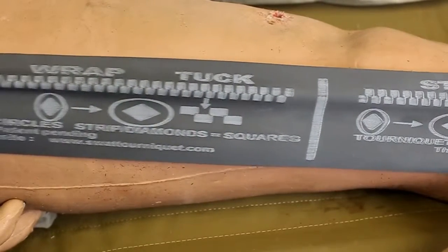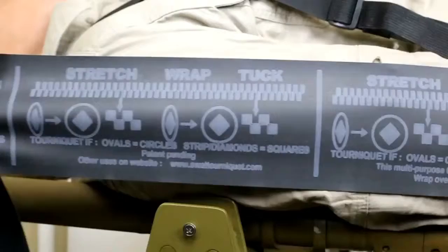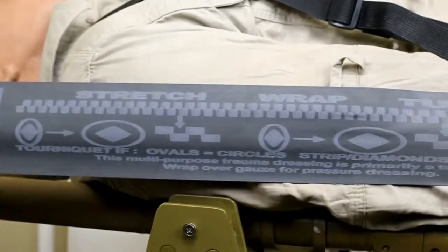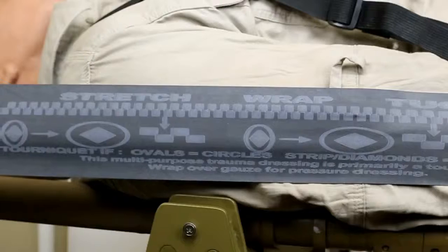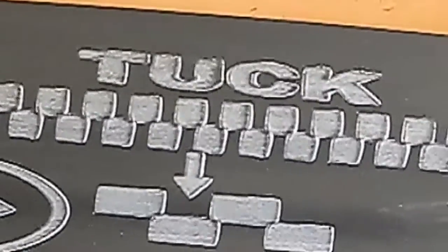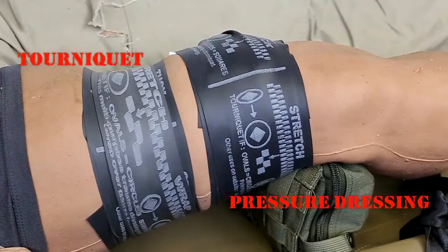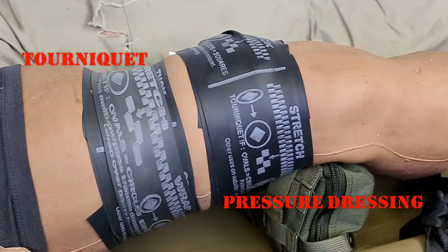The more the SWAT-T is stretched when wrapping around the limb, the more pressure it will apply. This will be indicated by the oval markings becoming circles and the diamonds in the center of the ovals becoming squares. Concurrently, the strip of rectangles above the ovals will become a strip of squares. When the SWAT-T is used as a pressure dressing, it should be wrapped tightly enough to apply pressure to the wound, but not so tightly that the ovals, diamonds, and rectangle strips distort to their tourniquet pressure indicator shapes.